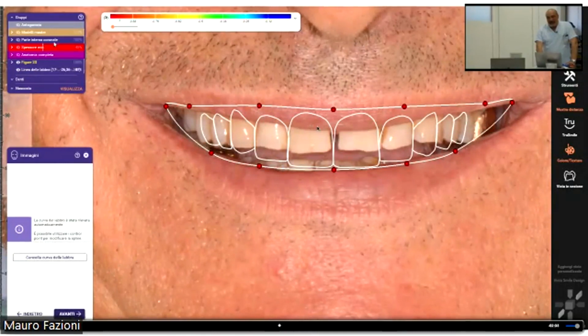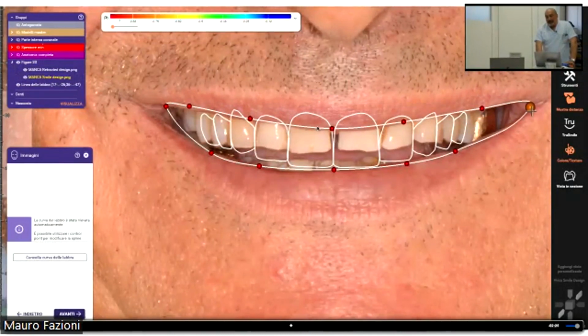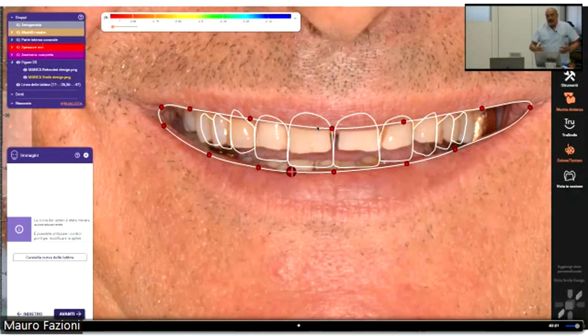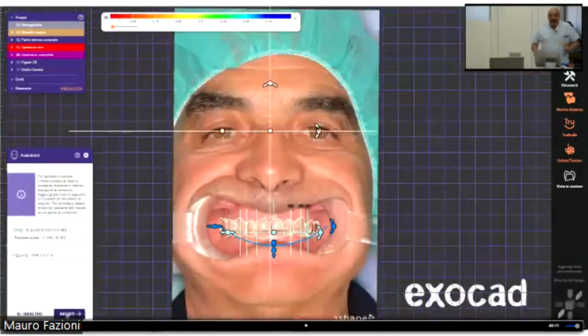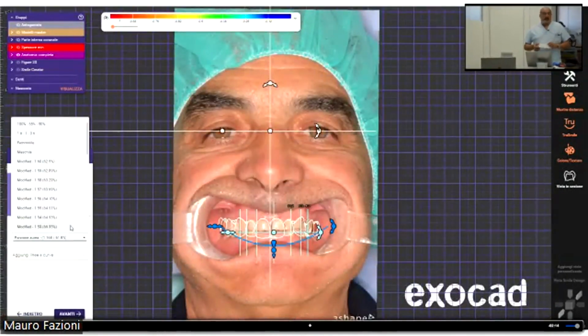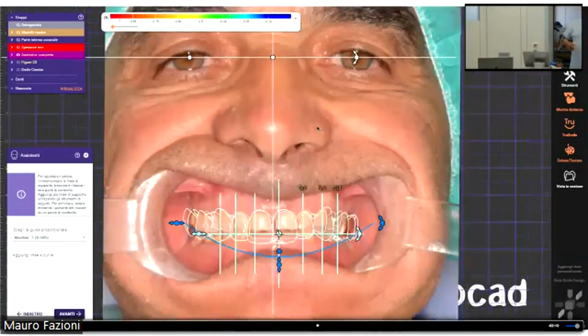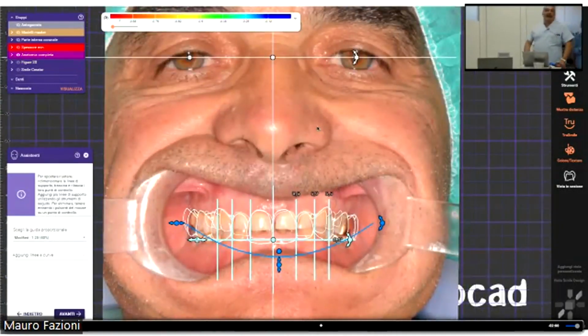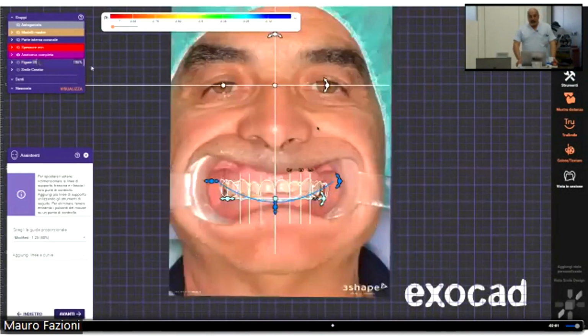Here you can see that all these steps must be collected, and we need to go with different software together in the same plan, because great software is very important when it can be collected directly and matched with other software.